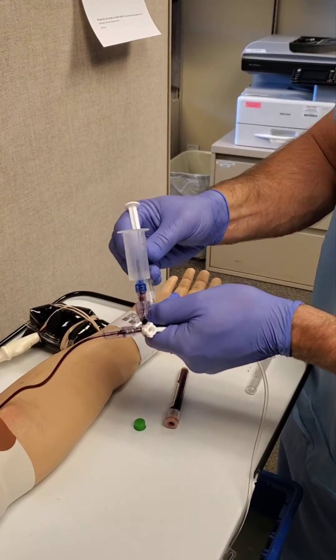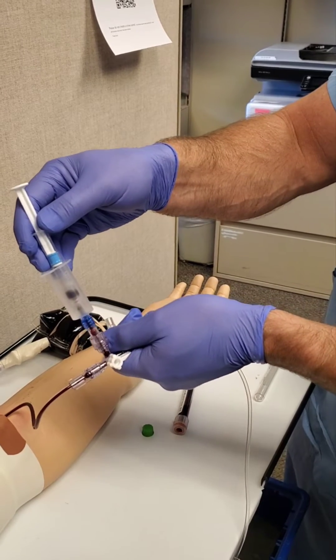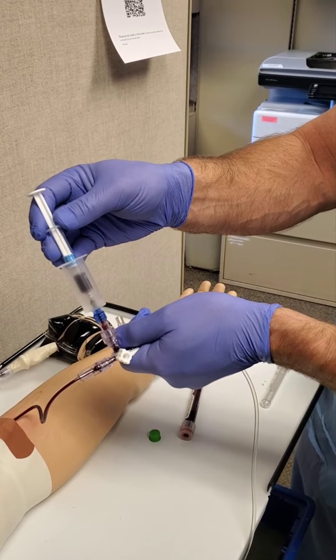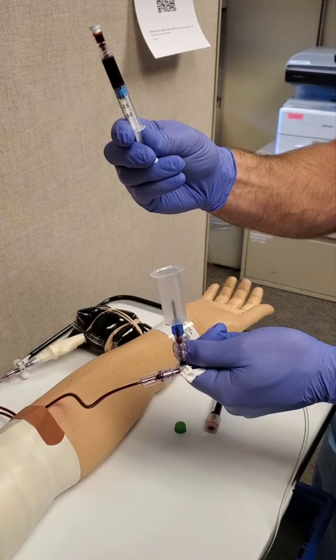Take your ABG syringe, remove the cap, and place it in the vacutainer, pushing the rubber stopper down and allowing your syringe to fill with blood up until the stopper. Then press the blood up into the cap until it fills.